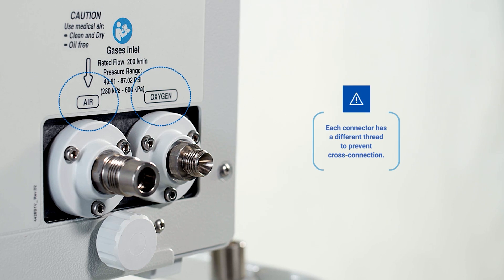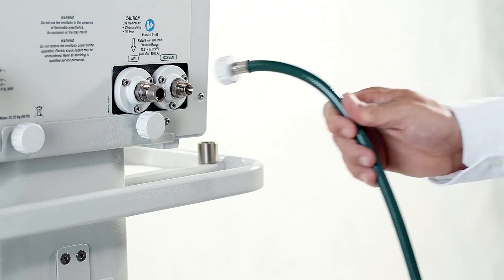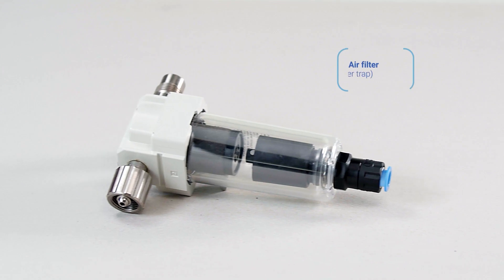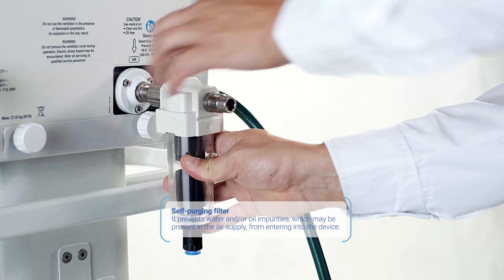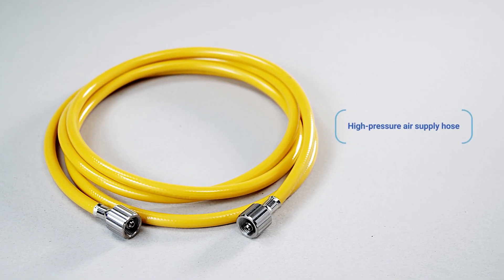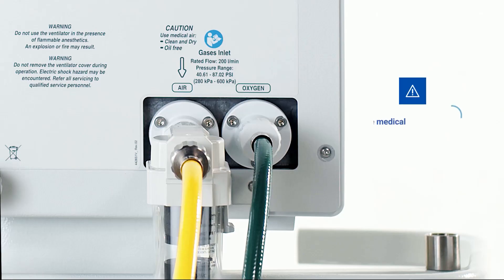Connect the following accessories to these connectors: a green high-pressure oxygen supply hose to the connector for oxygen, and an air filter or water trap to the air connector. This filter is placed between the connector and the high-pressure air hose. Connect the yellow high-pressure air supply hose to the filter connector. Connect the other end of the hoses to the main air and oxygen supply of the building. The supply pressure must be 280 to 600 kPa.